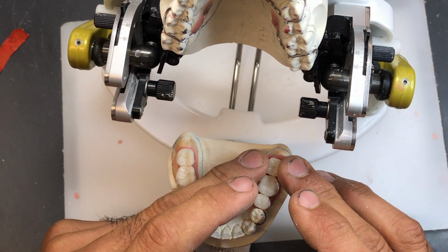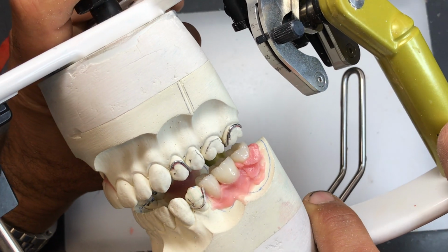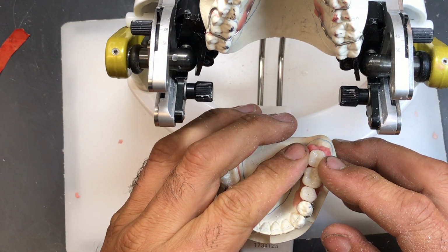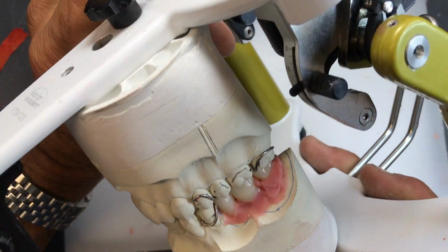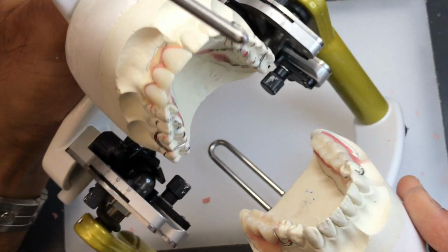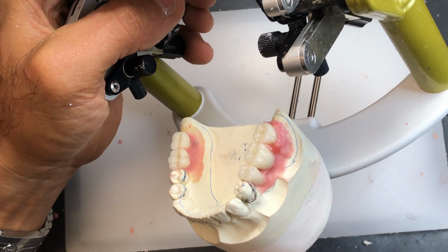So before my wax hardens up, I'm going to place this in an ideal position, just judging by the margins, central fossa, somewhat there, bring it together, and hopefully I'm at the right vertical where my incisal pin is slightly elevated, and it is, but I need to go a little bit more, somewhere there. So I'm looking for at least a 1 millimeter incisal pin opening now with this back tooth, the second molar, in order to create adequate centric contact. And it looks like I am. So I'm going to seal this tooth down. Try not to move it.